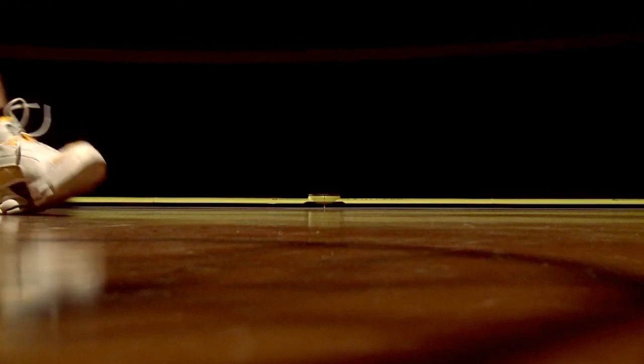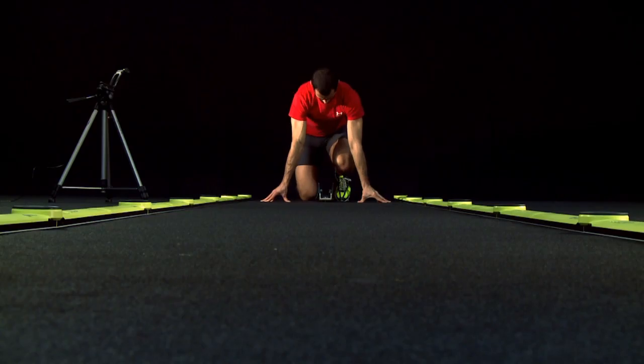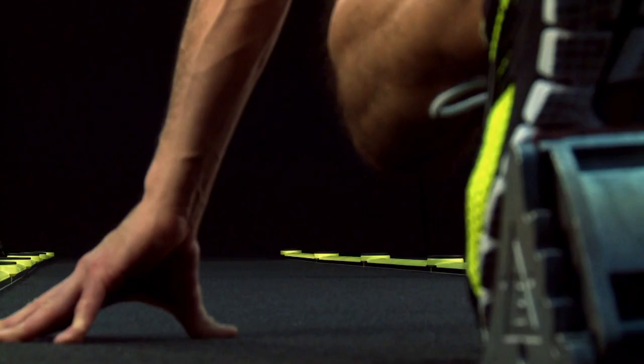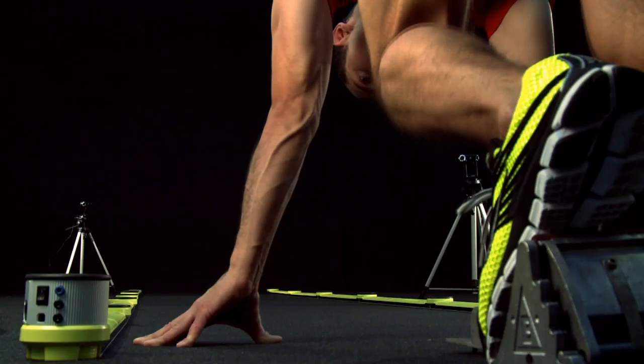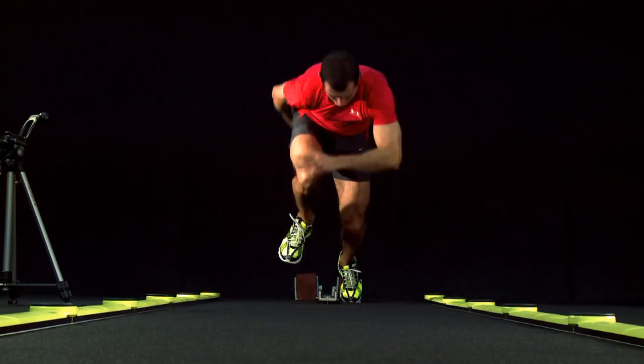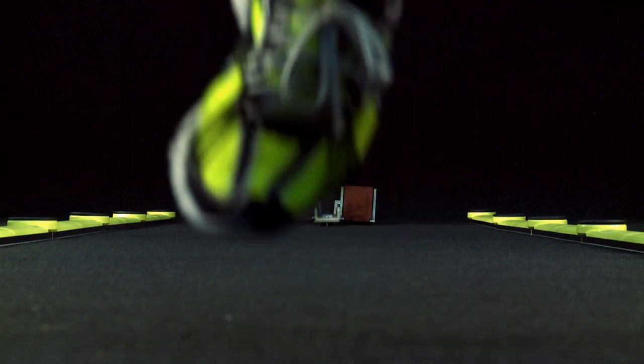measure endurance to different workloads and develop personal training programs on the basis of test results. It also allows users to periodically check athletes' improvements, create a database to compare athletes' data, examine an athlete's condition after an injury, develop an appropriate rehabilitation plan, monitor progress, and obtain an objective judgement when talent scouting or selecting athletes.